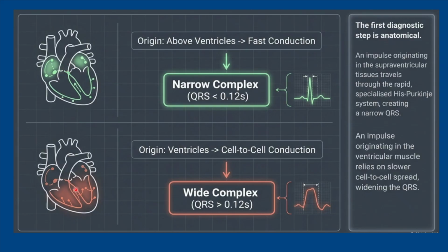And also, in the following lectures, we'll look at the ventricular arrhythmias in which the abnormal impulses are generated in the ventricle. Also, in our discussion, we'll discuss accessory bundles or pathways which could pathologically connect the impulses abnormally away from the normal AV nodal conduction.